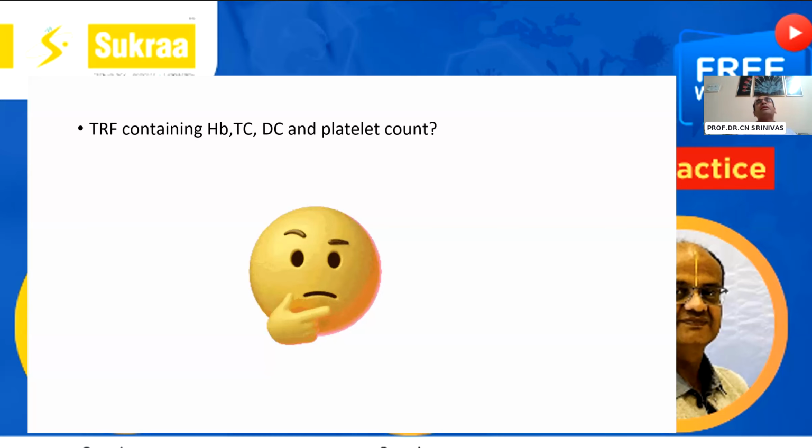The third reason is, again, for follow-up of patients, like follow-up of a dengue patient. The first day, you know the hematocrit, you know the platelet count. The next day, you may not necessarily want to do a TC again.